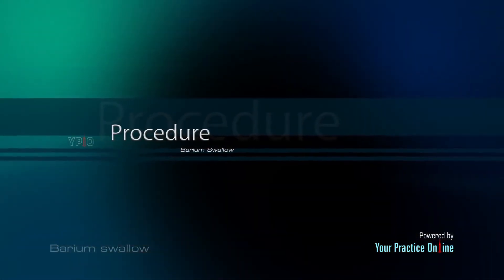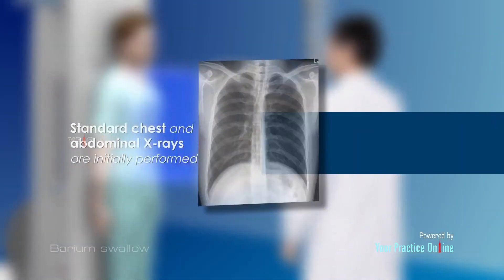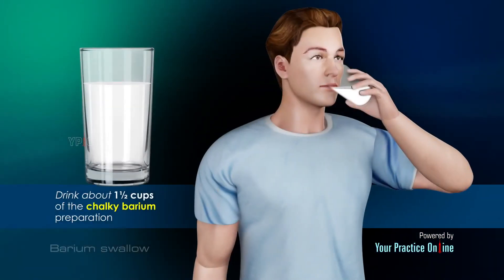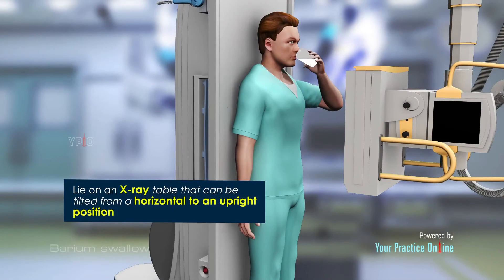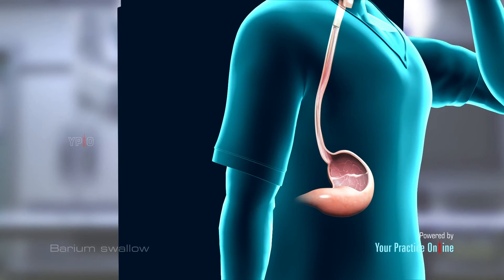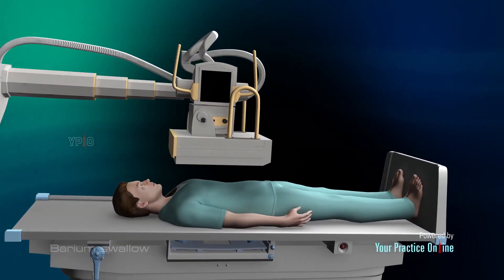A barium swallow test is performed in the following manner. Standard chest and abdominal x-rays are initially performed. You will be asked to drink about one and a half cups of the chalky barium preparation. You will lie on an x-ray table that can be tilted from a horizontal to an upright position. X-rays are obtained as you swallow the preparation and while the barium passes through your digestive system. The table will be tilted so that the barium spreads and x-rays can be captured at various angles.